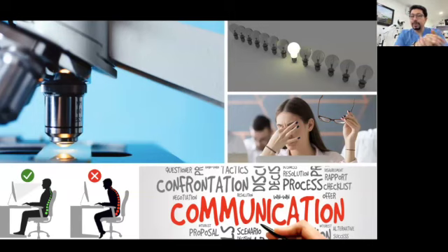The magnification is obvious, but a proper magnification cannot be properly applied if we do not have a proper illumination. And magnification and illumination nowadays, that most of the microscopes come with LED lights, we will have a very good illumination of the operative field. So these 2 things are related to the vision that we are going to have for working, and we will work more comfortable because of that better perception of the operative field.